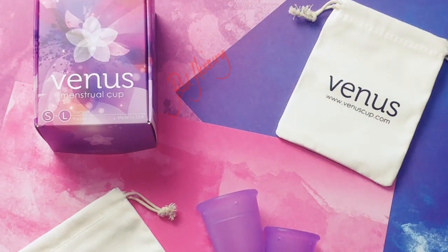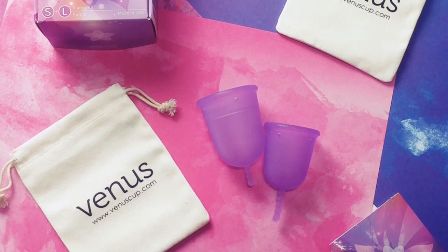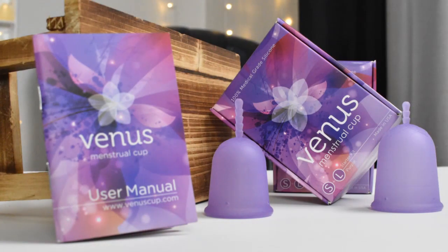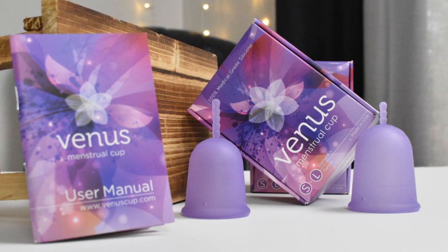Since I had so many requests for an actual review of this cup I'm going to skip over the unboxing, but I'll still go ahead and pan over some photos of what you'll receive if you order it. The Venus Cup is offered in the small and large separately, or you can purchase their starter pack with both sizes for a slightly discounted cost.